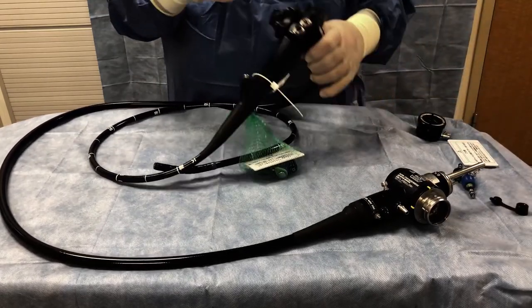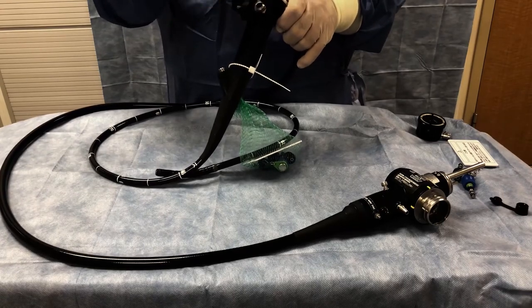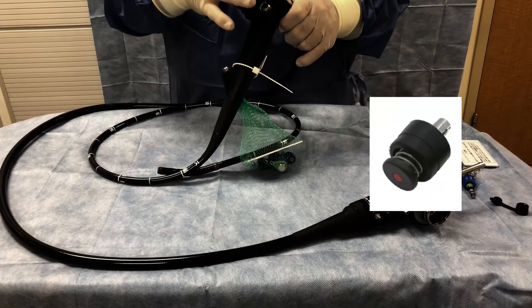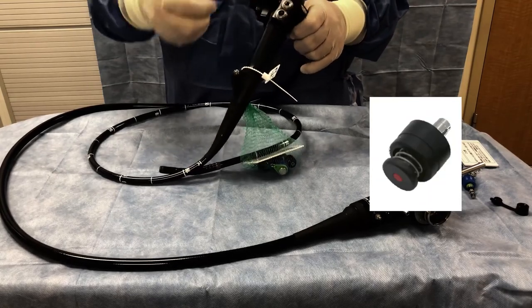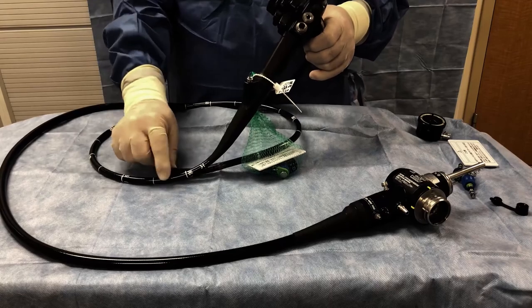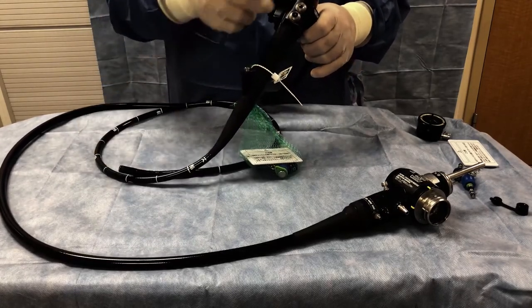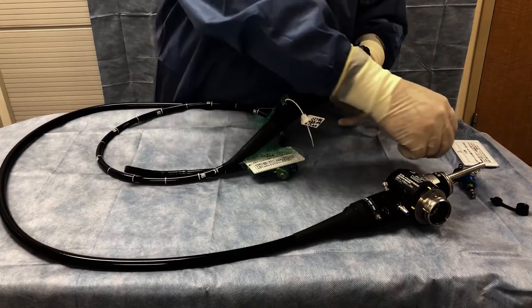This valve here goes in the upper port and it is used for suction. By pressing in on this button during the procedure, we can suck or aspirate fluid from the tip of the scope to keep things cleaned up.